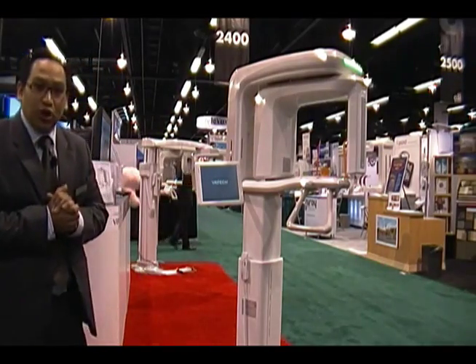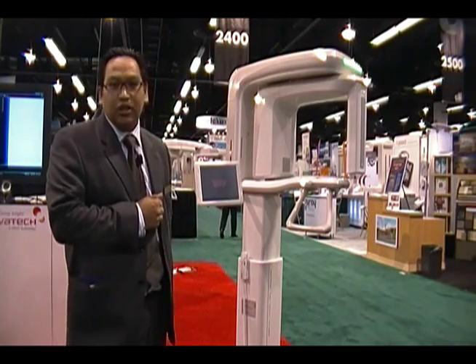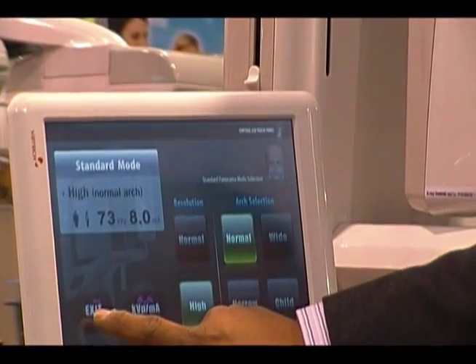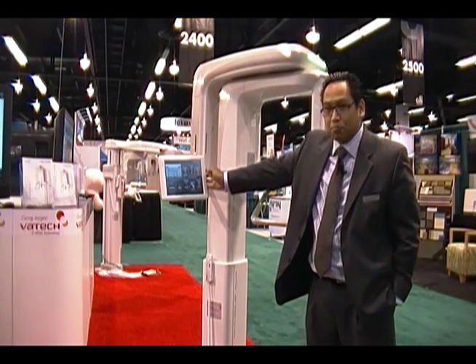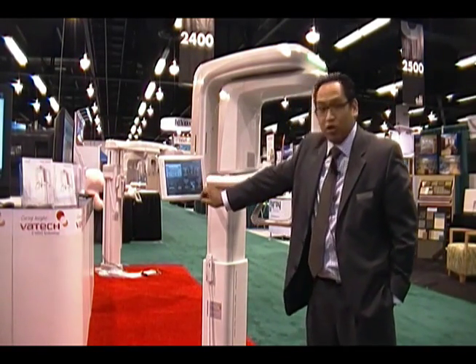For scenarios where you do want to link it into your operatories, we have the capability of linking it into your Cat5 cable and tying it into the rest of your network. We also have a touchscreen display here, and in order to operate the device, all the controls are done through the touchscreen.